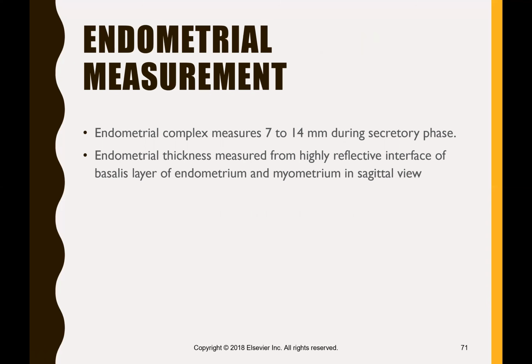And it's going to be echogenic, and there's going to be posterior acoustic enhancement during that time. If you think about it, the endometrium's job is to create a very nice fluffy home for a zygote if it decides to go. So that's why it's getting all that beautiful vascular blood flow, and it's just getting ready for that baby. That's the whole reproductive system's goal, to get pregnant every month.